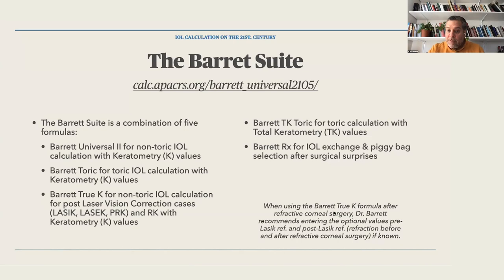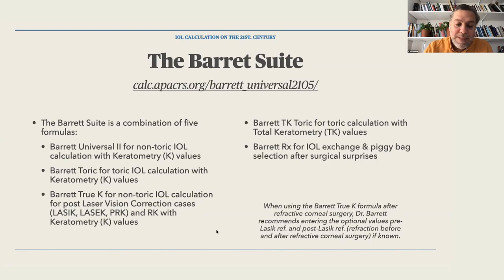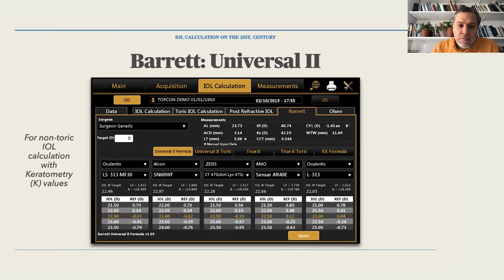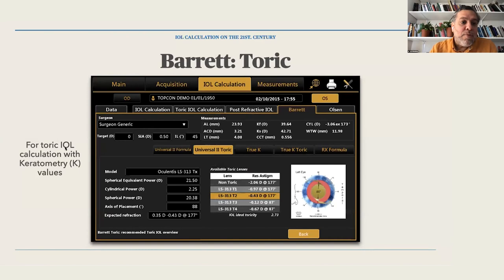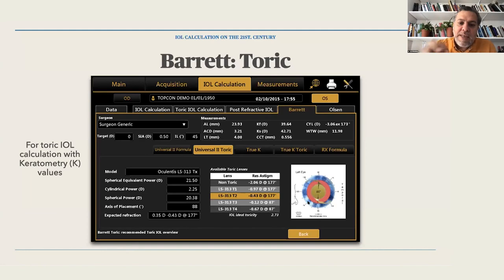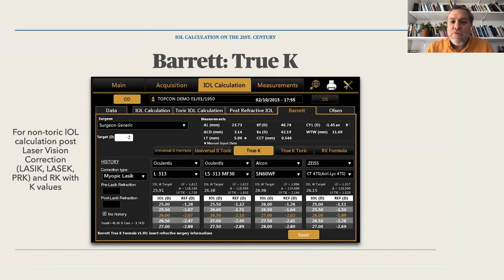According to Dr. Barrett, when using the True K formula after refractive surgery, he recommends entering optional values of pre-LASIK and post-LASIK refraction if known, as the formula then performs even better. The Barrett Universal 2 online calculator shows all five formulas. For Barrett Toric, you even get a simulation of where to place the incisions — almost the same as the manufacturer's toric calculator.